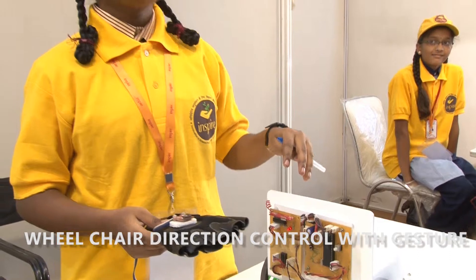A manual wheelchair costs about 80,000 to 250,000, but our power wheelchair costs 55,000 to 120,000. This is less expensive, very easy to handle, and user-friendly.